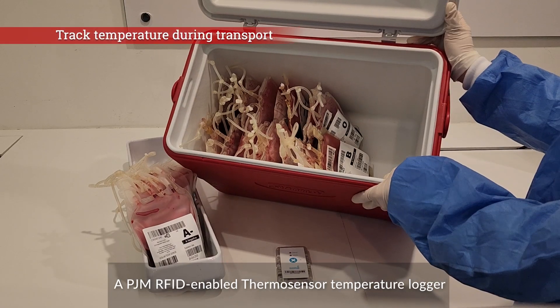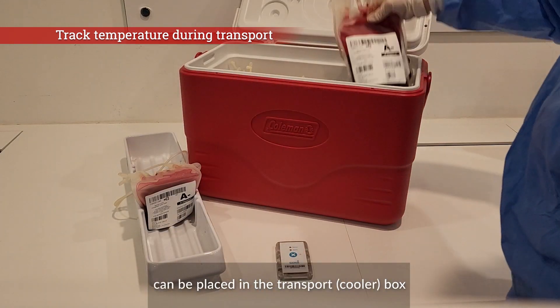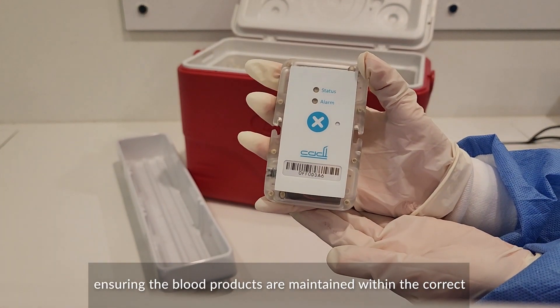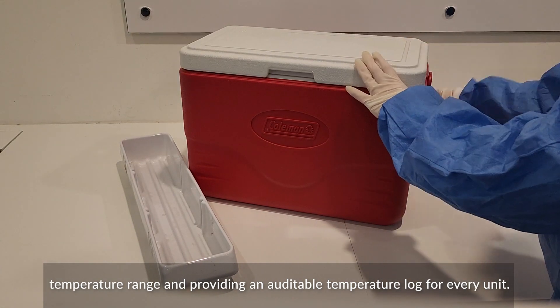A PJM RFID-enabled thermosensor temperature logger can be placed in the transport box to track the temperature of the blood products during transportation, ensuring the blood products are maintained within the correct temperature range and providing an auditable temperature log for every unit.